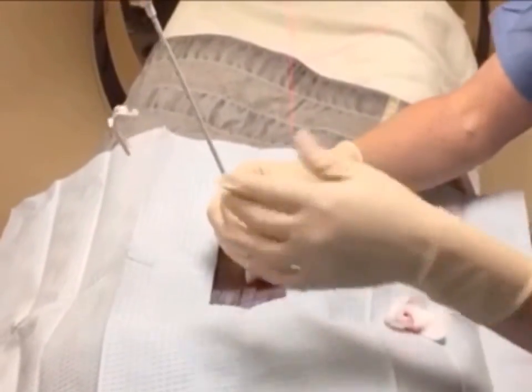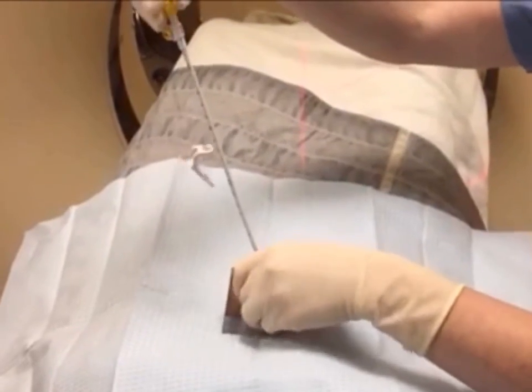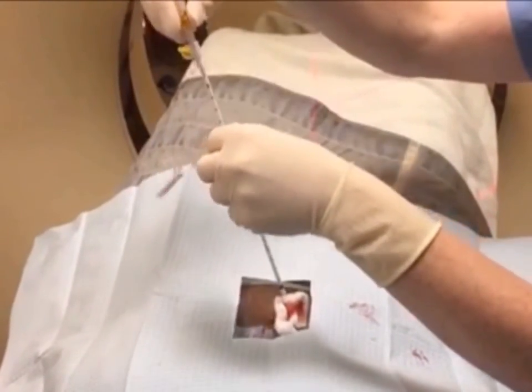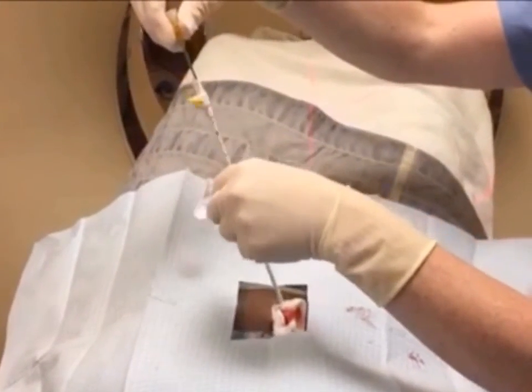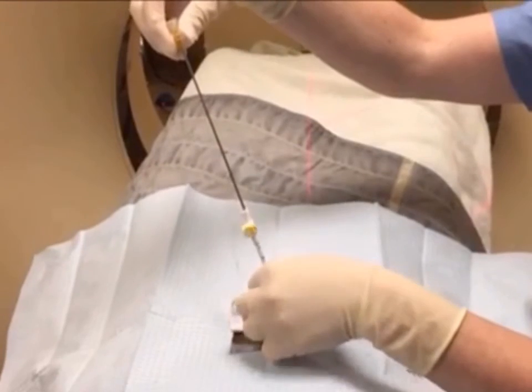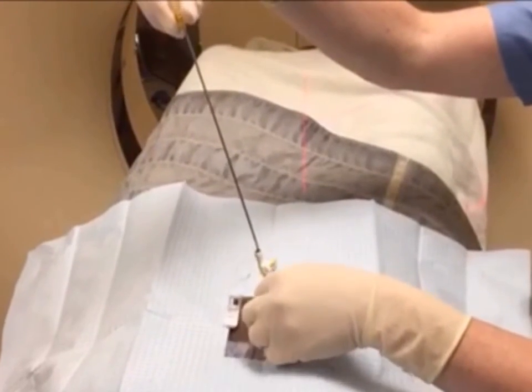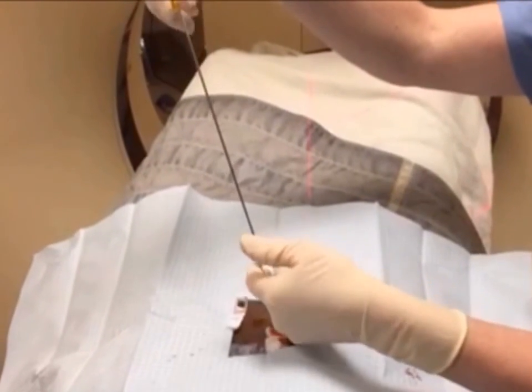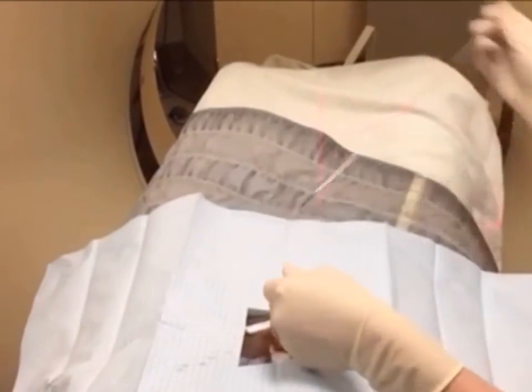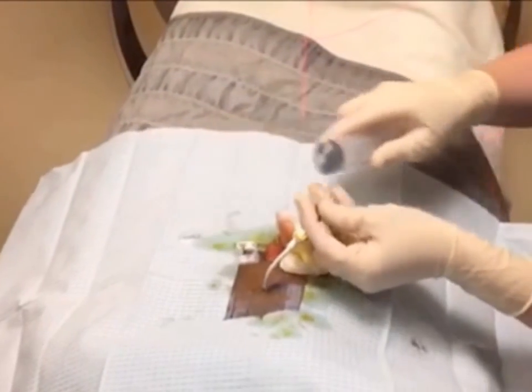Once the catheter has been advanced to the appropriate depth, unlock the catheter from the stiffening cannula, and holding the cannula steady with one hand, feed the catheter into the cavity. The cannula is then withdrawn. It is important to make sure that you do not feed the cannula along with the catheter into the fluid collection.